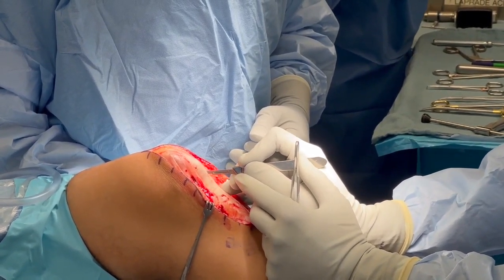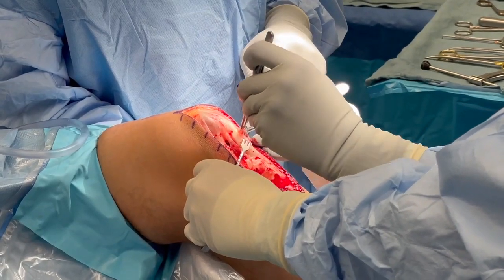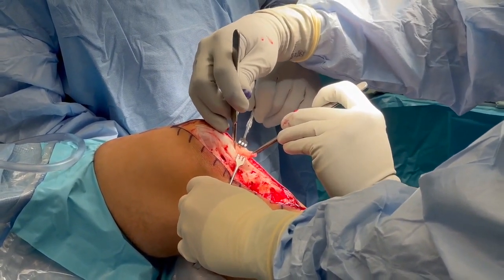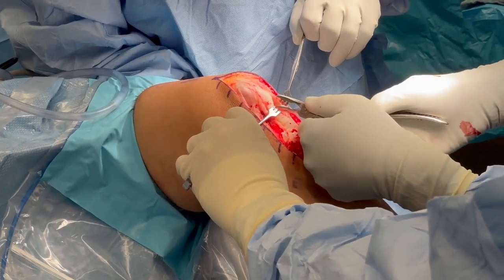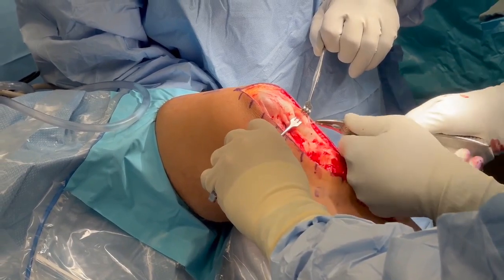To remove these tissues, a vertical incision was made and all the non-viable tissue was removed with a scalpel and rongeur until normal appearing tissue remained. This vertical incision will be closed at the end of the procedure. For this patient, about 70% of the tissue at the deep and central aspect at the superior pole of the patellar tendon was detached, thickened, and irritated.